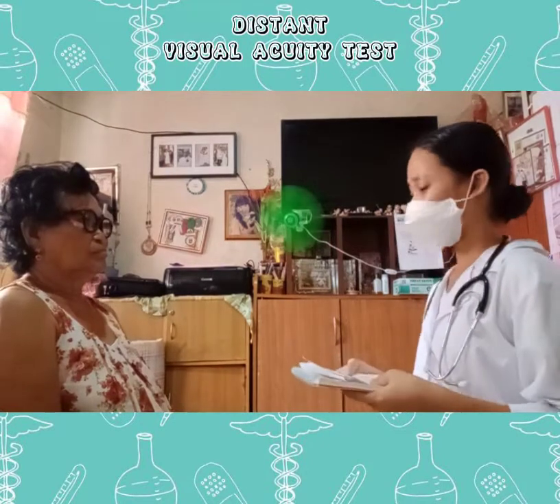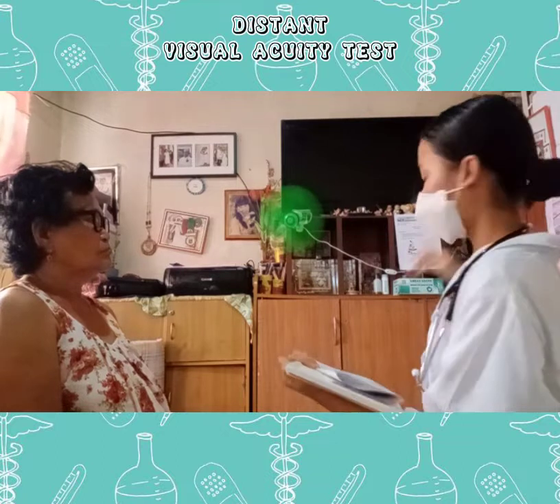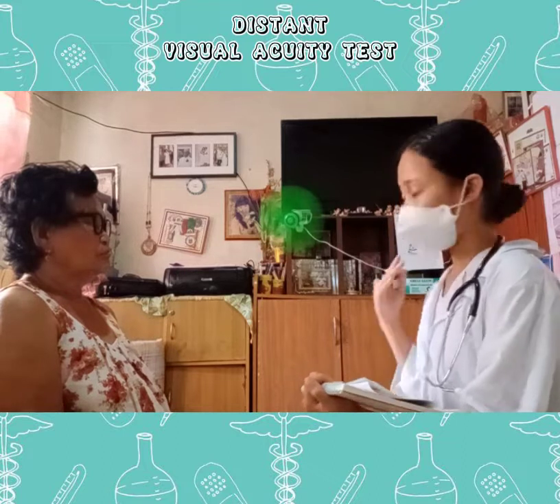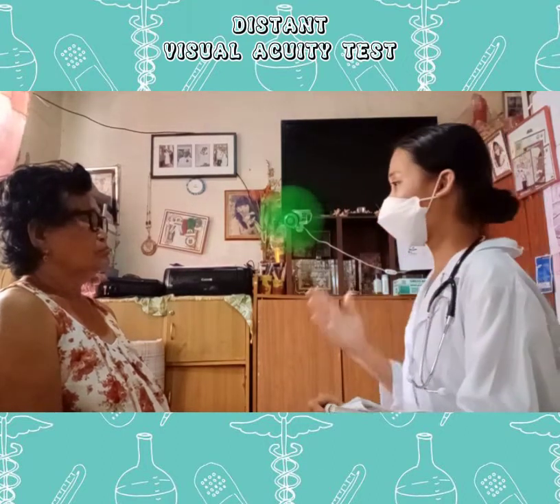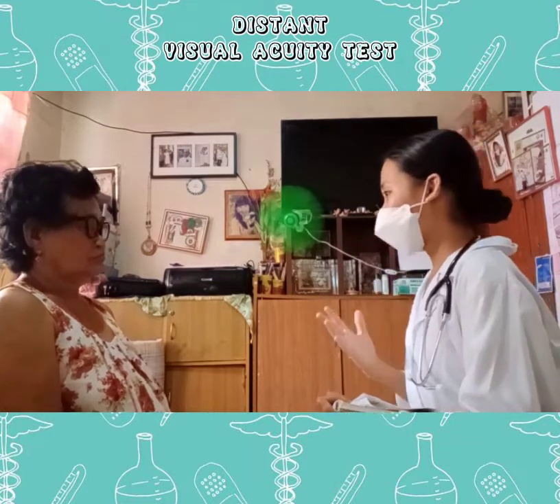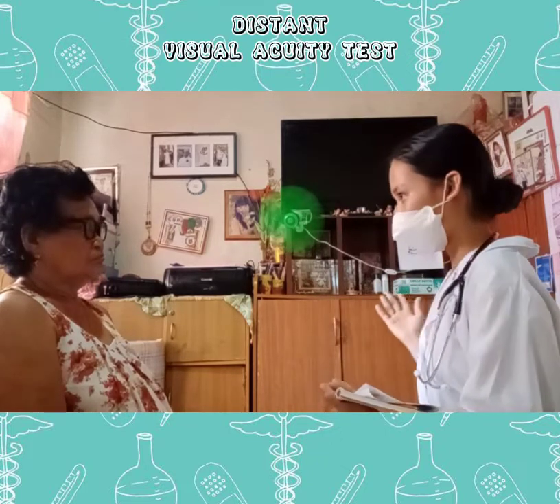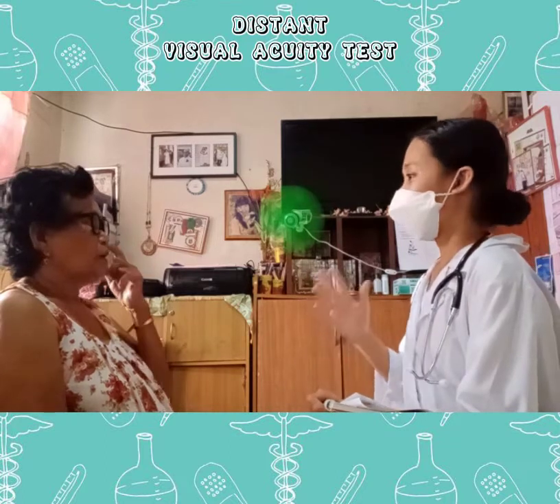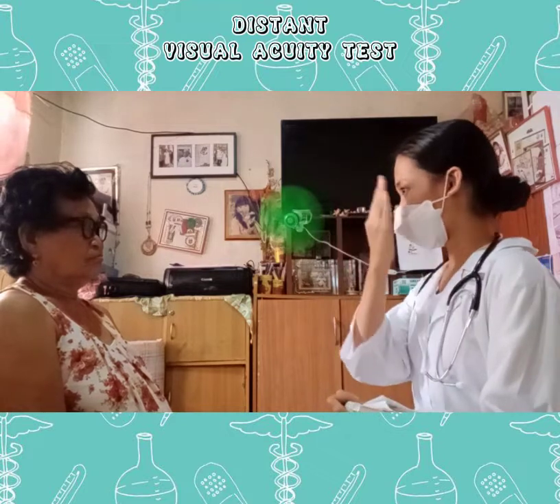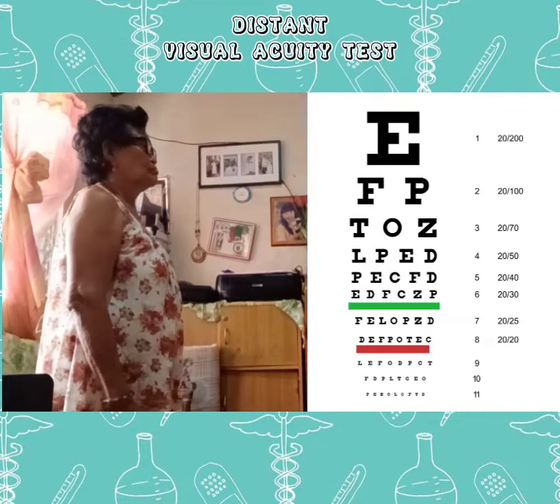So for the visual acuity, you will be tested using the Snellen chart which I posted on the wall. This test is called the distant visual acuity. I'll be pointing to some of the letters and all you need to do is read them. I'll be requiring you to stand since this test requires a 20 feet distance from the Snellen chart. You need to read with both eyes, then cover one, and then cover the other side. Okay? Let's start. Kindly read it with both eyes now.